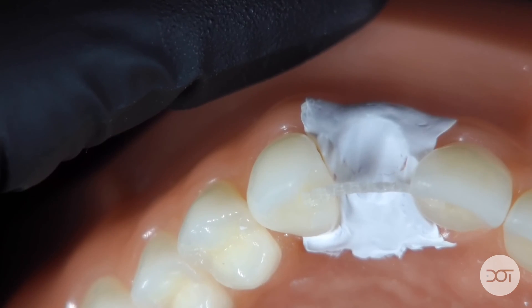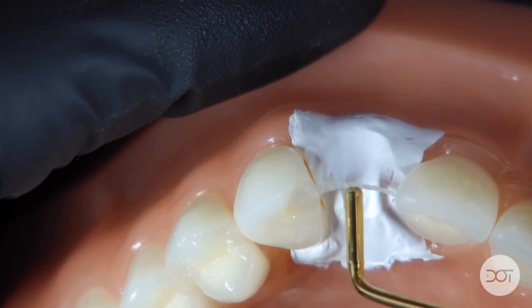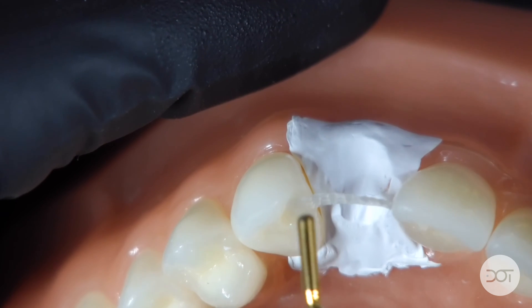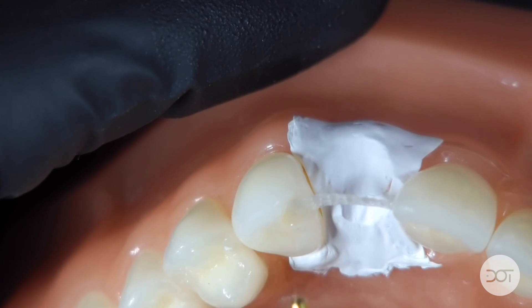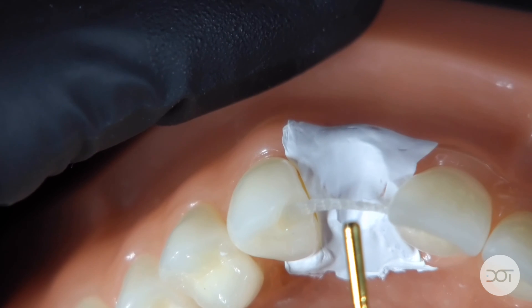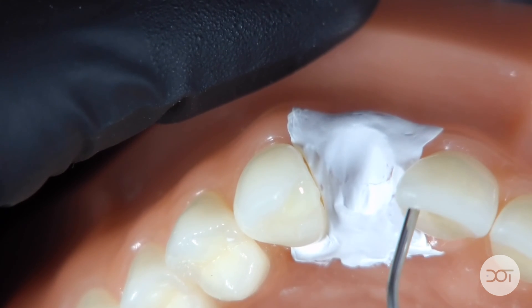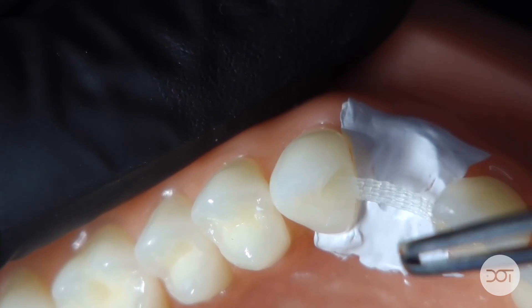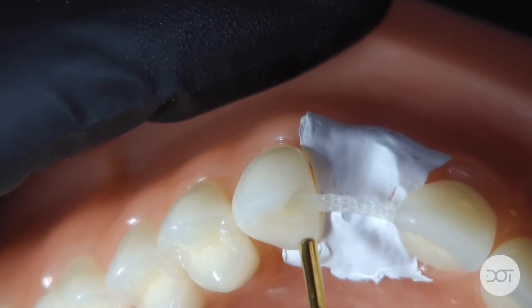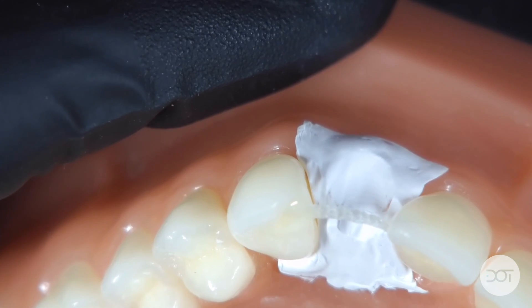What I want to do is create a curve — almost a C-form — to the rib bond, so it sits into the center of the pontic instead of toward the palate. I'll use an instrument to bring the rib bond material more into the body of the pontic. I'll show you here with flowable composite — a hybrid flowable — placed on both the mesial and distal contacts of the bridge. Then I take the rib bond and seed it into that flowable composite, using a rounded blunt instrument to keep the ribbon seated. It's critical to place flowable composite first and seat the ribbon into it, not the other way around.